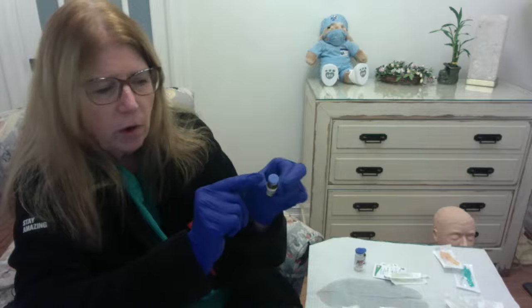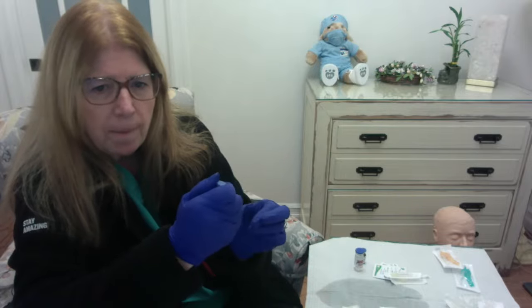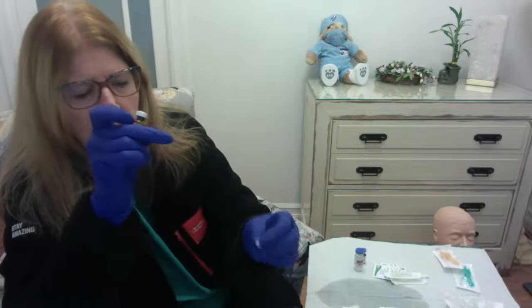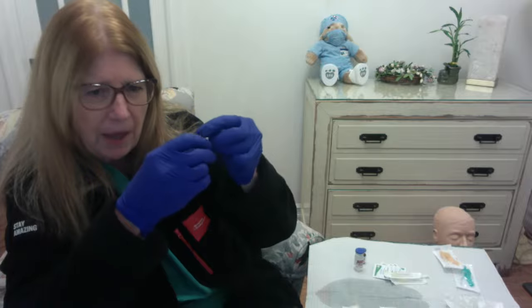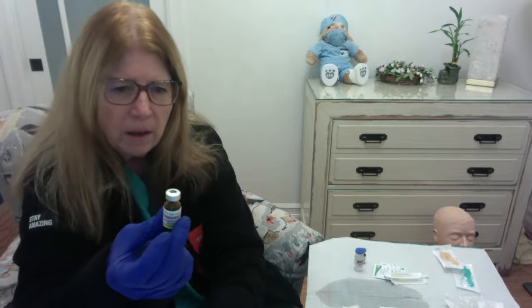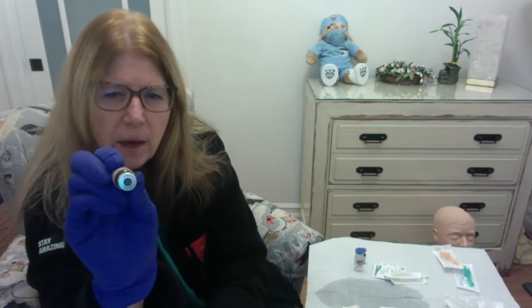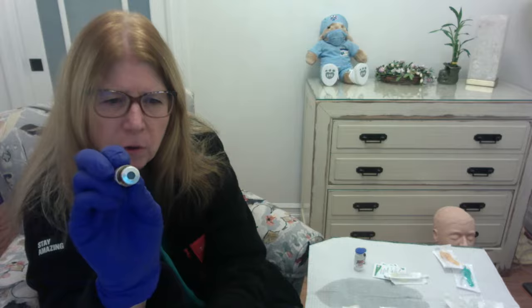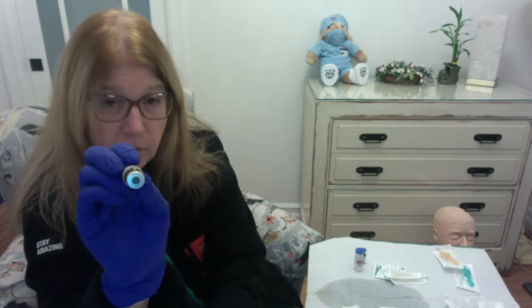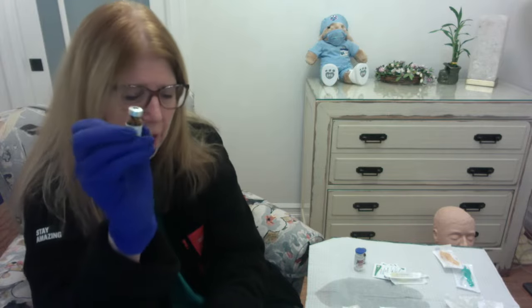So these vials come with a small cap on the top. If you use your thumb to just flip off the cap, okay, the caps are disposable. You can't put the cap back on. It doesn't stay. All right. So once the vial has been opened, you'll notice that at the top there is a rubber stopper, and there is a little circle in there. You might not be able to see it on the video, but you'll be able to see it with the naked eye, where you're going to insert your needle.